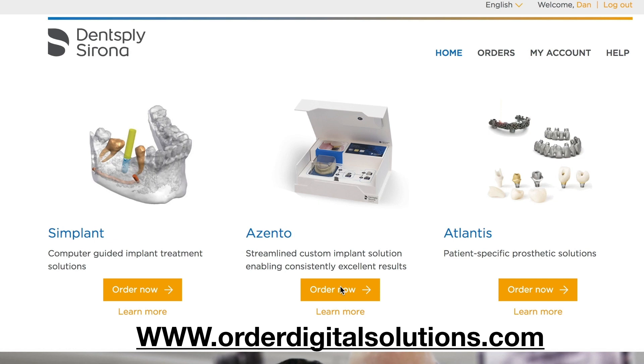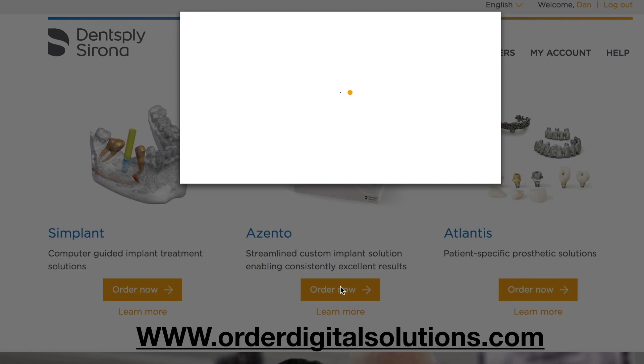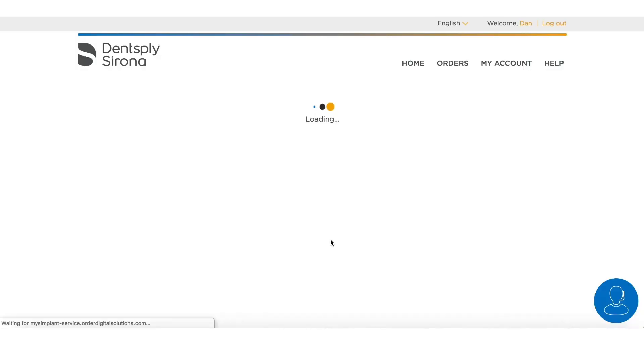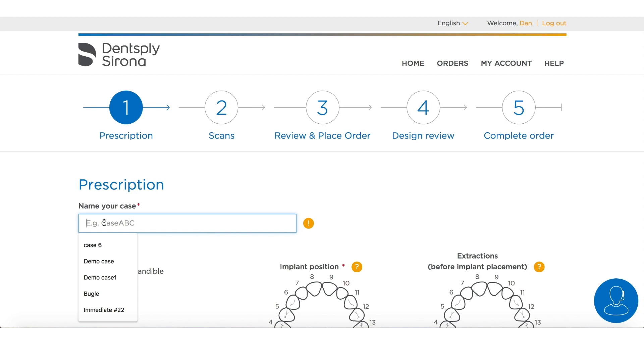Once you click Order Now, the prescription is going to show up and there are only a couple of things you need to do to fill out the prescription.